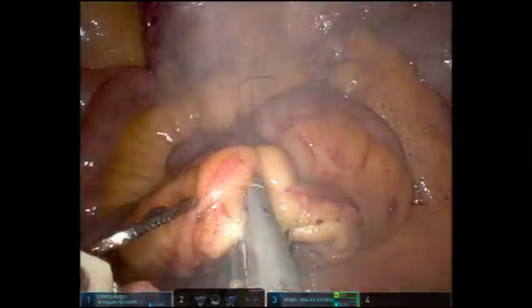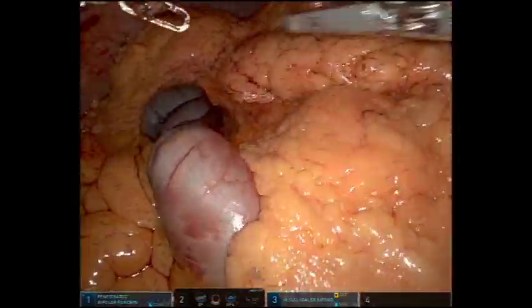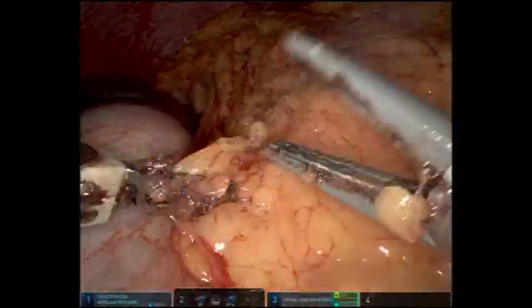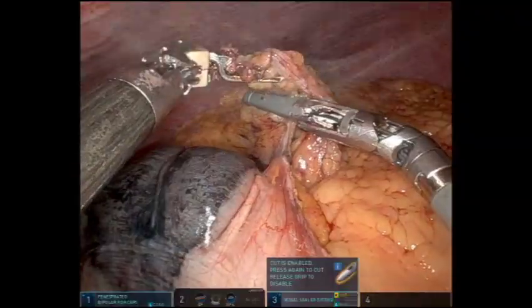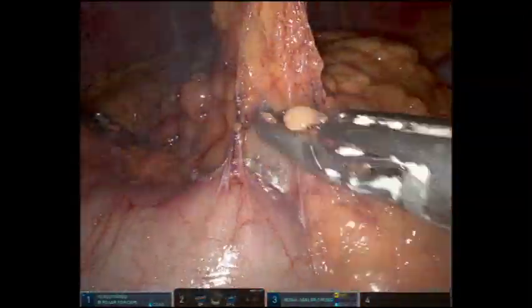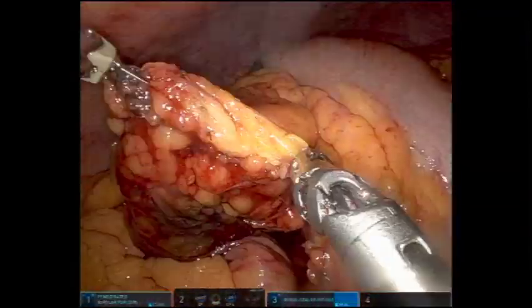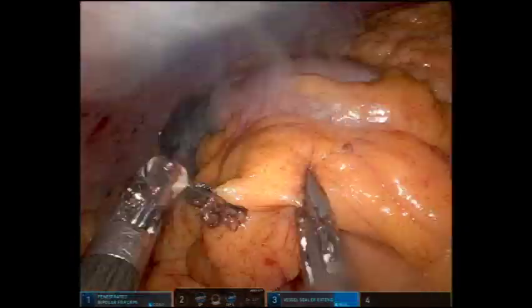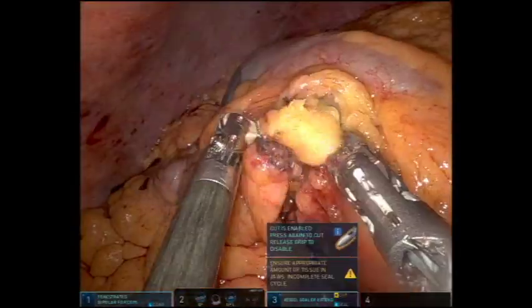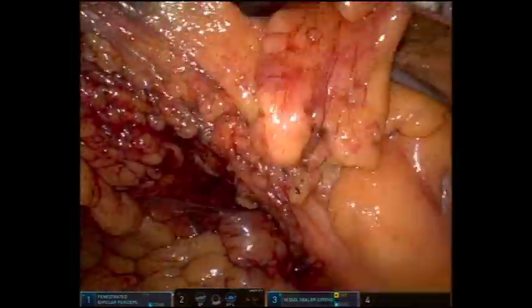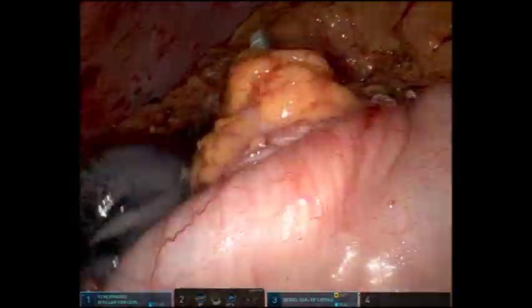The ileum is grasped and easily reaches up toward the transverse colon. The omentum is mobilized away from the transverse colon distal to the tumor, allowing the involved omentum to be included with the specimen. The remaining transverse colon mesentery is then transected using the vessel sealer down to the bowel wall. An instrument is placed under the colon ensuring that all attachments have been taken down.